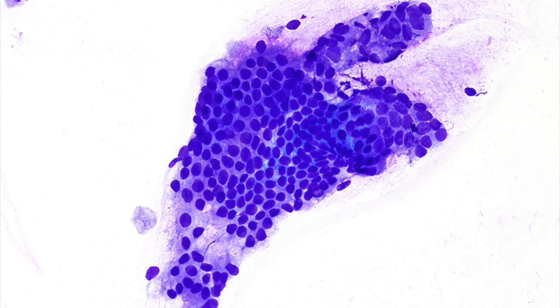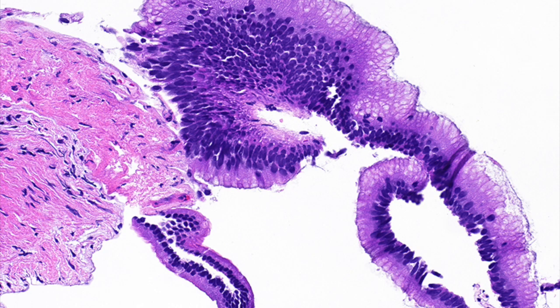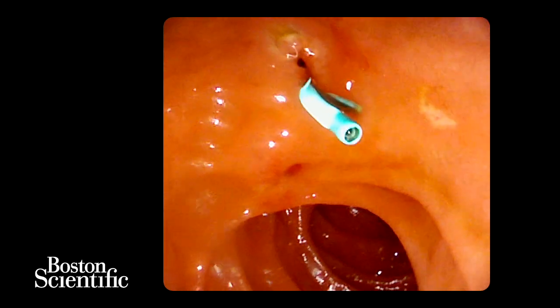SpyBite biopsies revealed high-grade dysplasia on rapid on-site evaluation, which was confirmed on cell block. The patient was referred for a Whipple procedure.